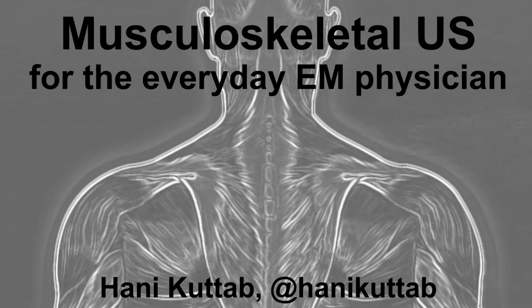Hi everyone, this is Hani, one of your ultrasound faculty, and I'm going to spend some time talking with you today about musculoskeletal ultrasound and how to best incorporate this helpful tool into your everyday emergency medicine practice.